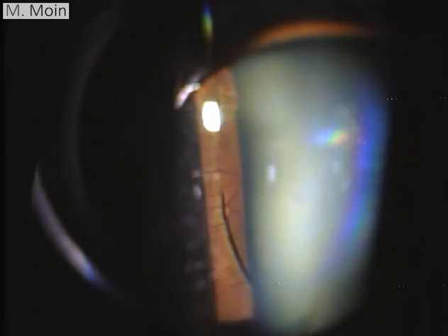This was an area of resolving SRF which I saw over here. And as I move the slit around, you will see cryo marks. The important thing to remember is, if you have an 80% fill of oil and the retina is attached on the buckle inferior to that, that means the retina will remain attached if you remove that silicone oil. Because if there's 80% fill and there is no detachment, that signifies that the inferior retina has attached. This is the nasal retina which is seen over here on the buckle.